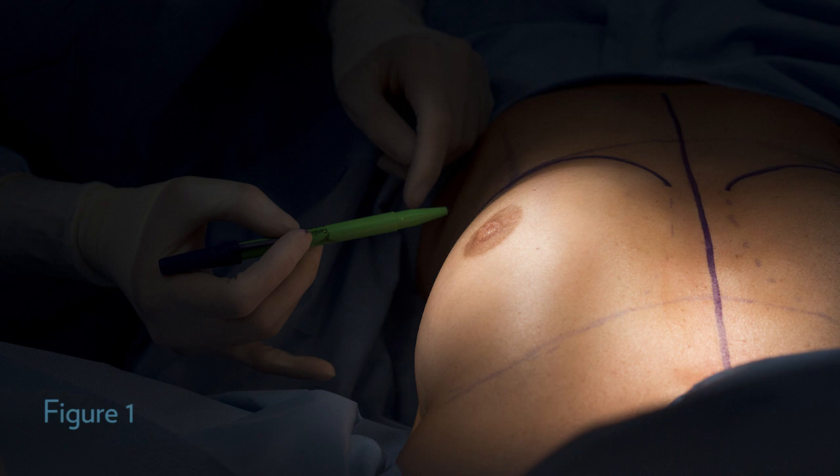In this picture I've marked out the boundaries of the dissection for the nipple-sparing mastectomy. You can see the line along the inframammary fold, a line down the middle to mark the sternum, and then another line across the top of the breast to mark the top for the plastic surgeon for reconstruction. This is how we prepare all of our cases so that we know the true boundaries to help not only the surgical oncologist but also the plastic surgeon.